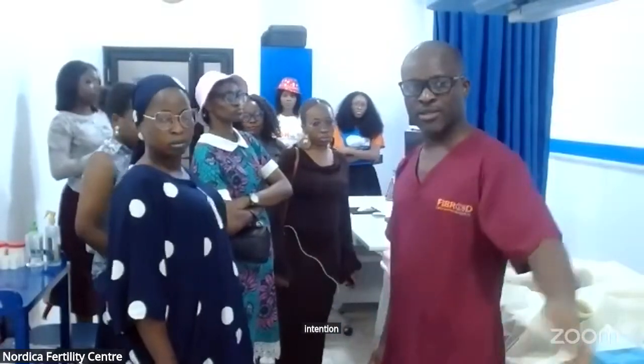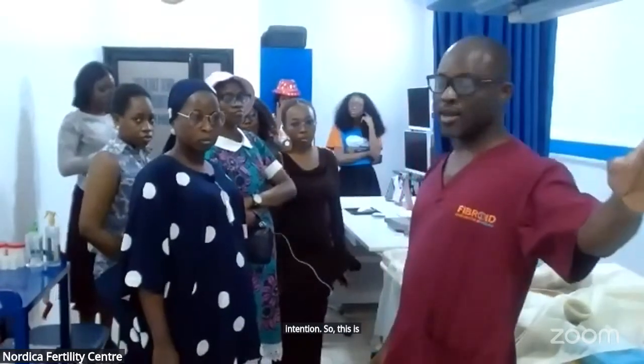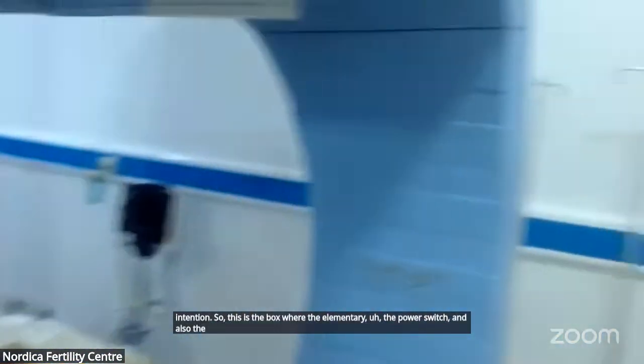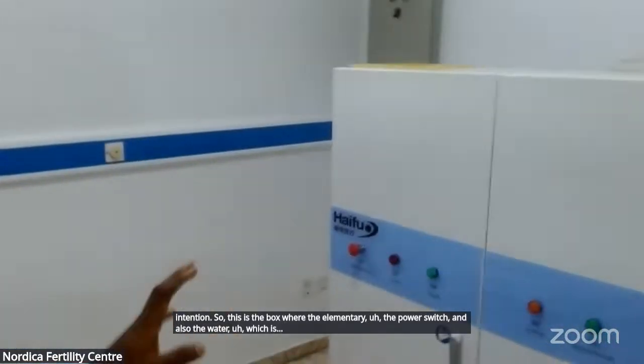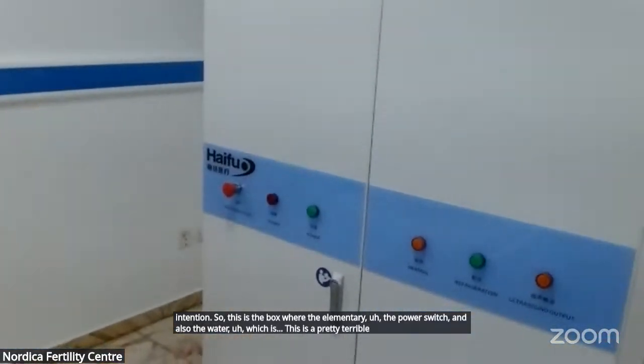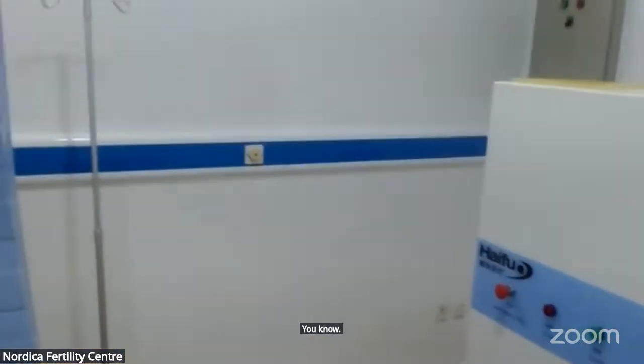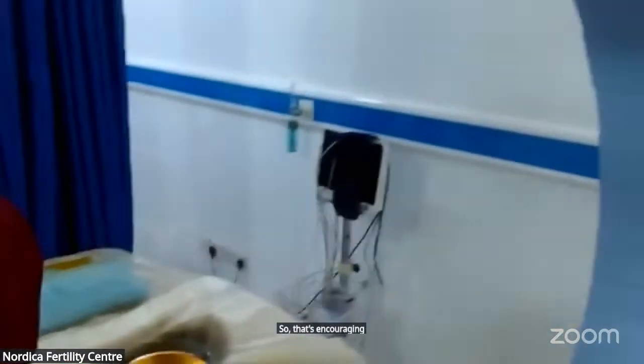So this is the box where the power source is, and also the water. This is treated water we put inside this filter. So that is just the HIFU machine.